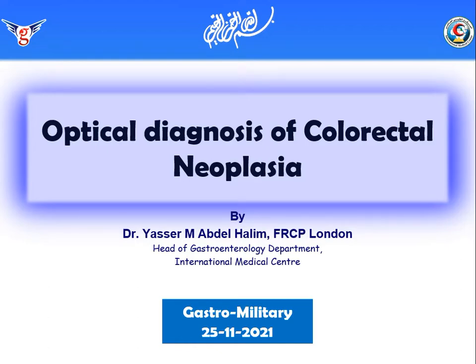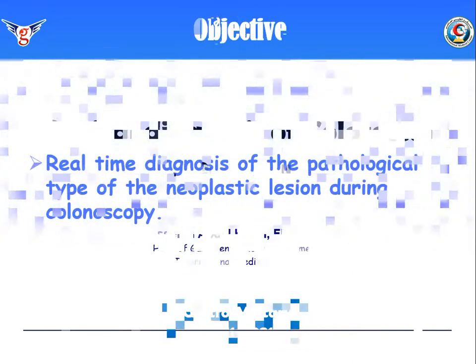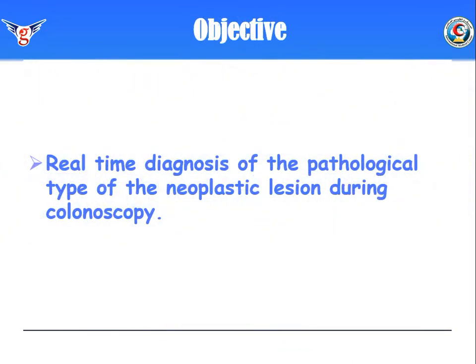Optical diagnosis of colorectal neoplasia. My objective in this presentation is to present to you the current evidence of how to make a real-time diagnosis of the histopathological type of the neoplastic lesion during colonoscopy.